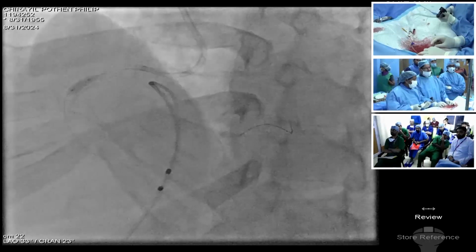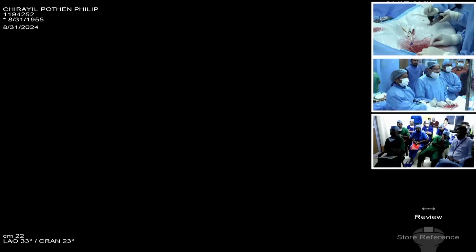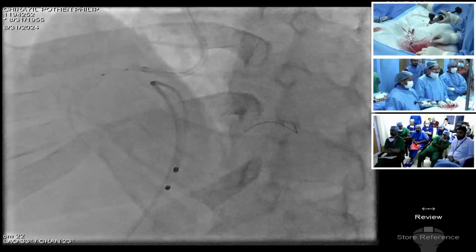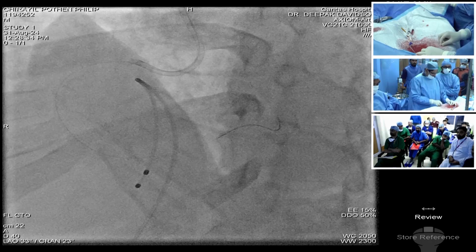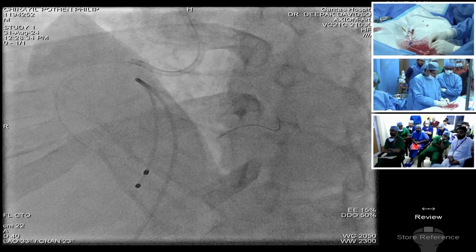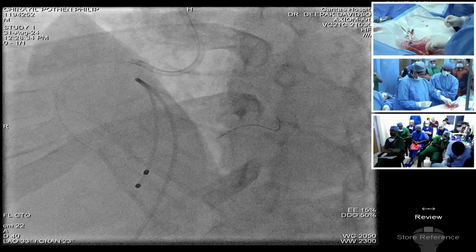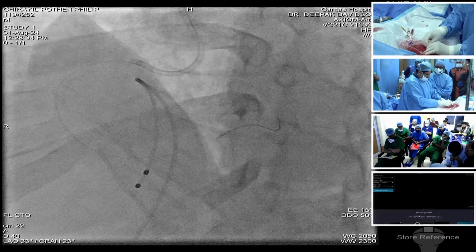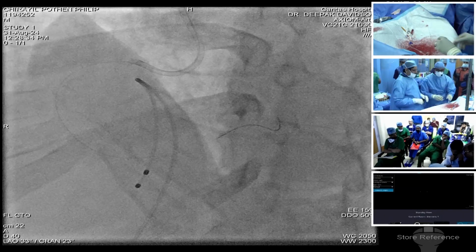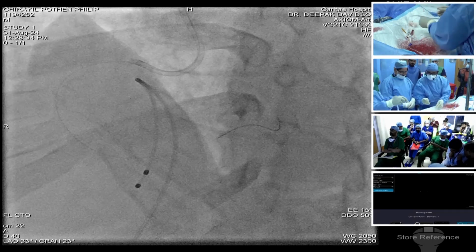18. Defect. Okay, now we'll again go with the OCT catheter. Small dose of noradrenaline. Okay, we'll go with the OCT, and then be ready with the stent also, because the balloon has opened up well. We do not have any intention of further modifying the plaque. We'll understand what has been done by the balloon with the help of the imaging catheter.